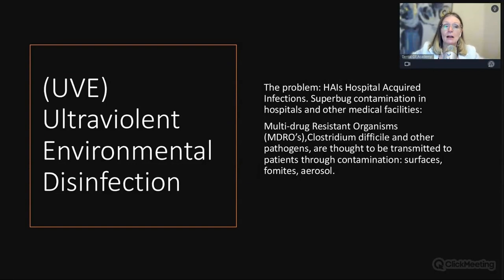We have to be concerned about, is our infection control practices enough? Do we have contamination remaining on our counters or our units? If you are using the wipes that we were just talking about in the C. diff course that are quaternary ammonium wipes, they are not sporicidal. So you're leaving some stuff behind.